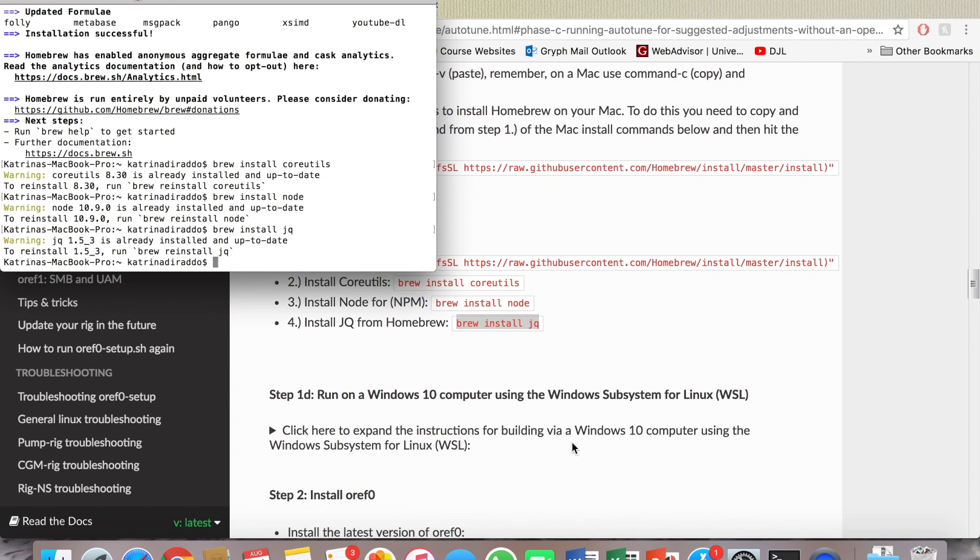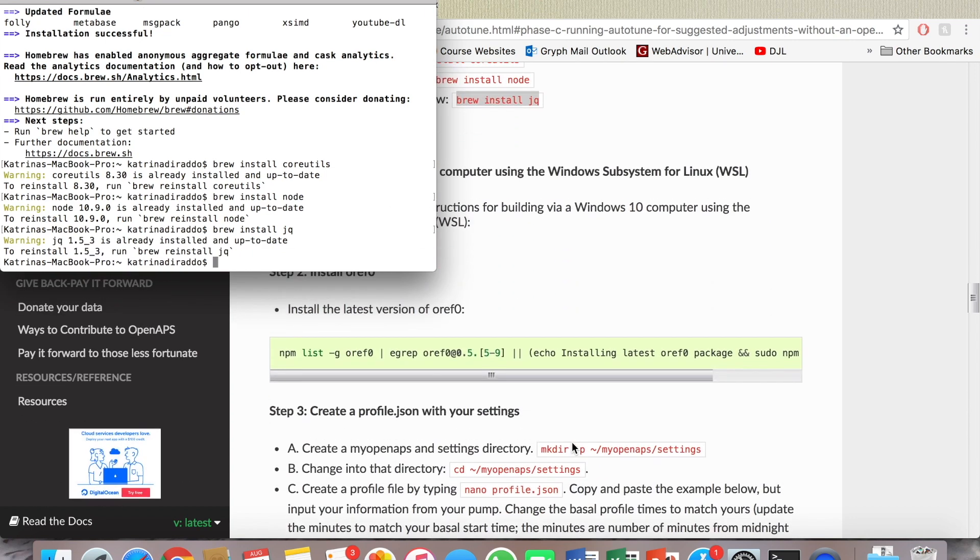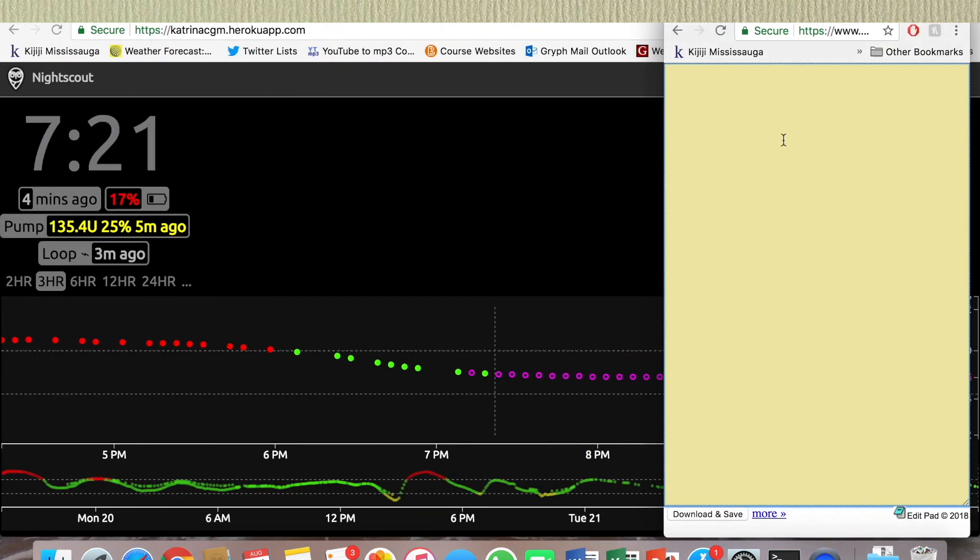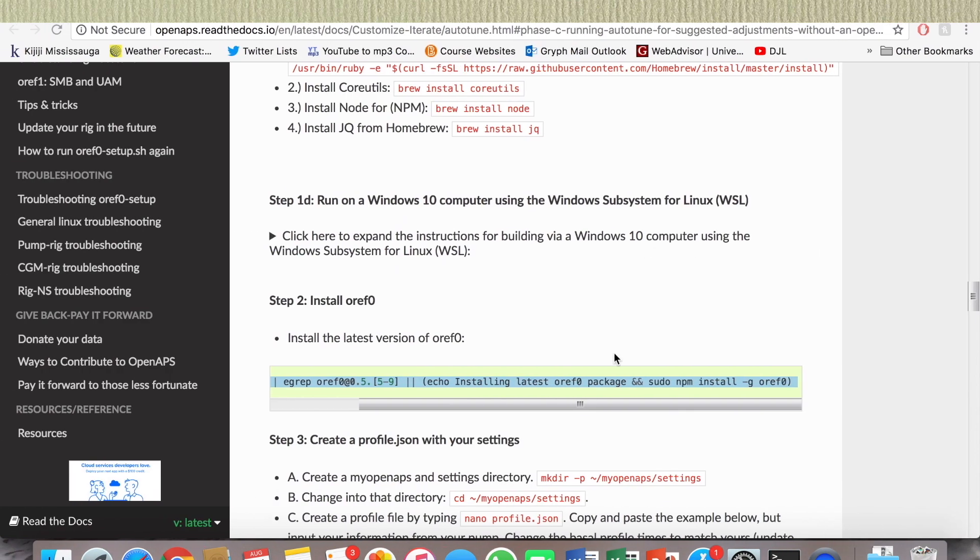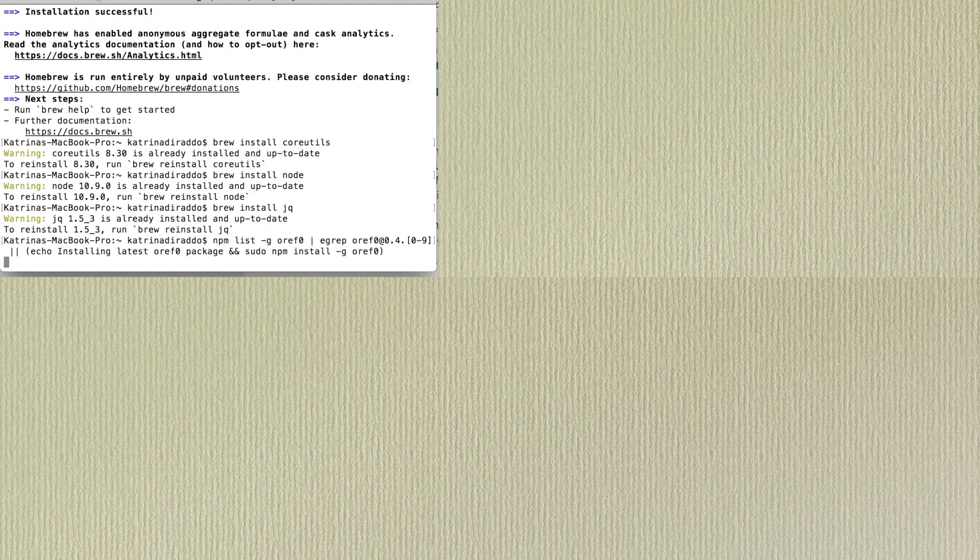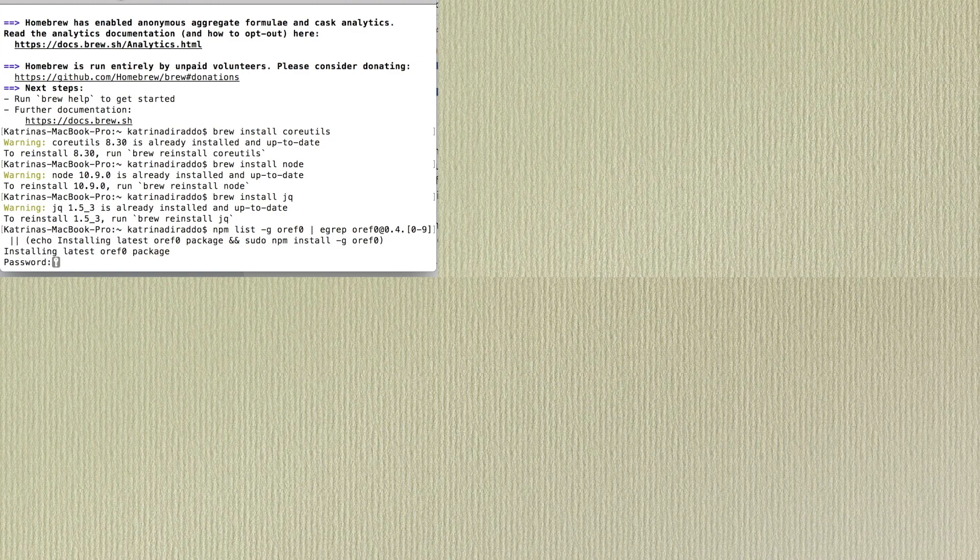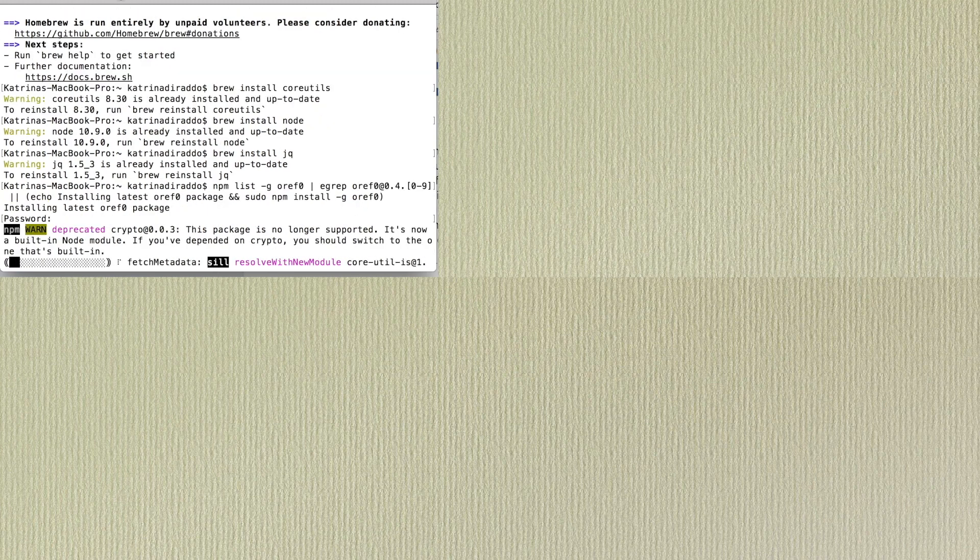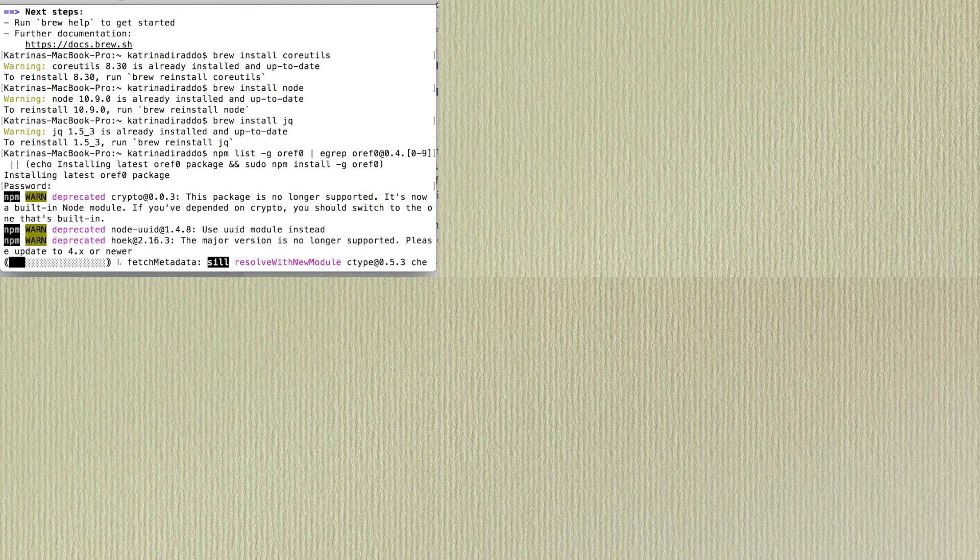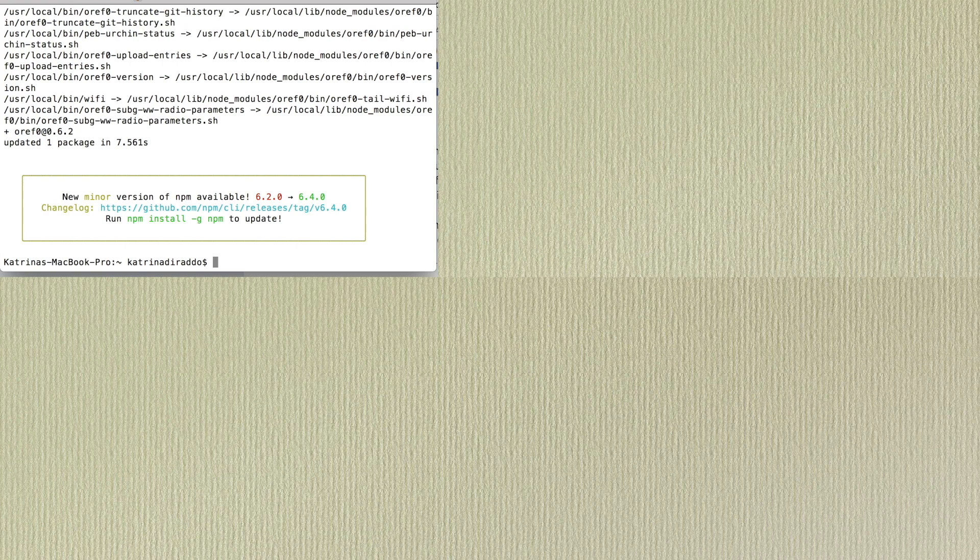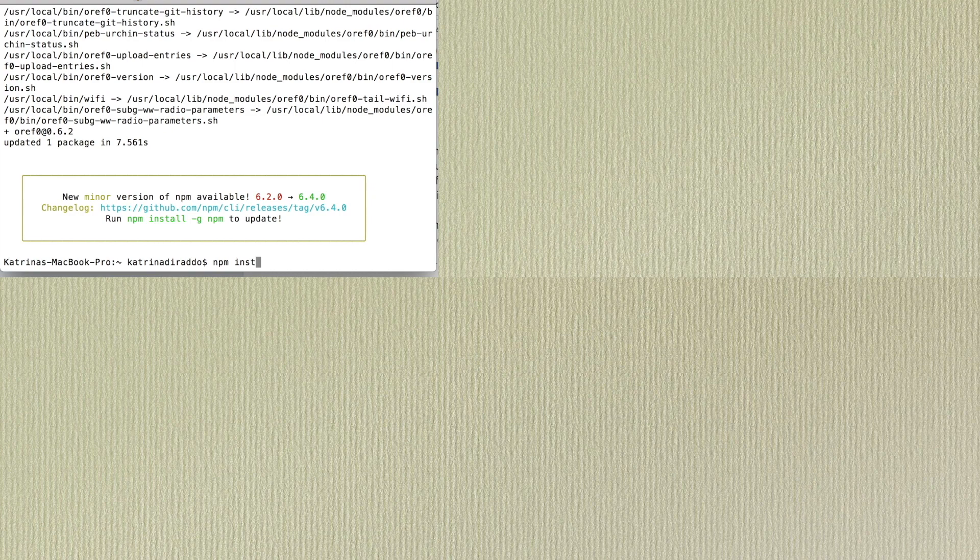Okay, so install the latest version of oref zero. I have on the side here a plain text editor. Password. Package is no longer supported, new minor version available, changelog. So if it says run that, do I just copy this install space g npm?